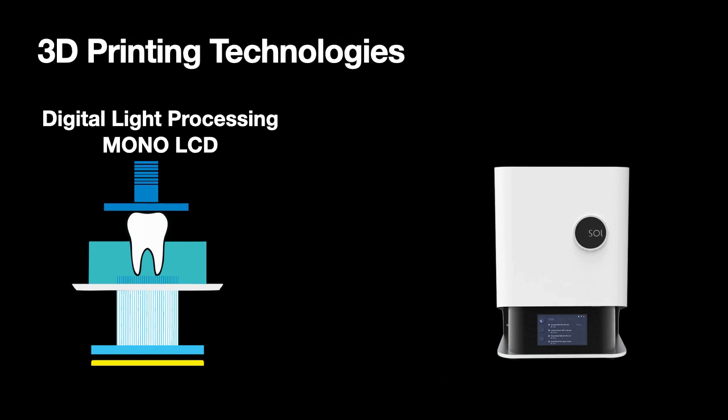So if the filters are not very sharp, you tend to get very blurred borders, or you tend to get flakes around the 3D printed product. And also, speed is an issue with the LCDs. The life of the LCD itself is an issue. So you need to consider all of these factors when you go in for an LCD printer. They are cheaper, but they will require replacements much sooner.